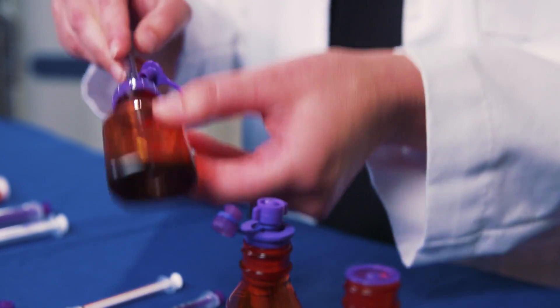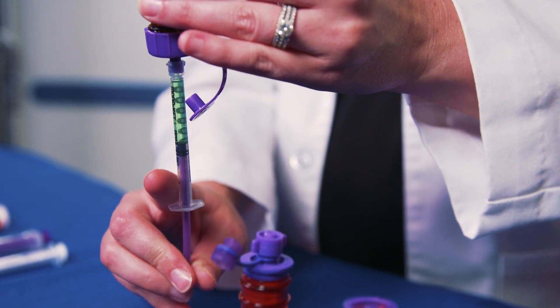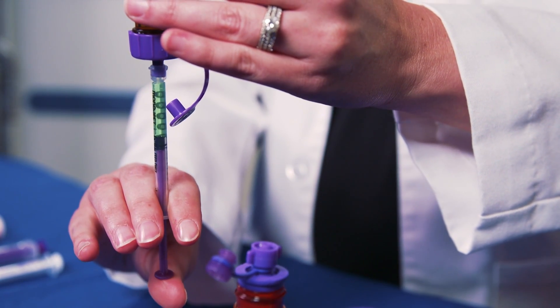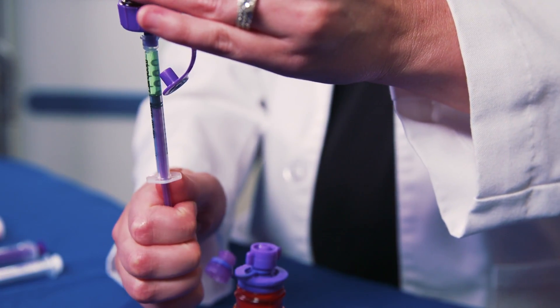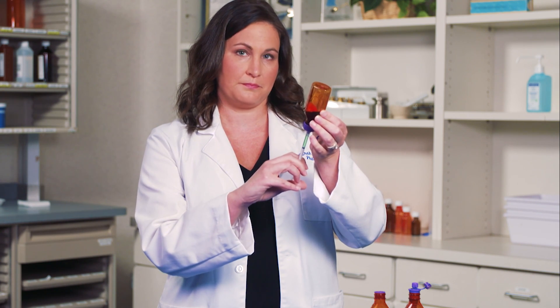Gently turn the medication bottle upside down. In a gentle but quick motion, pull and push back the syringe plunger to cycle it once or more. This helps eliminate any air bubbles in the syringe. Then pull the plunger back to the desired amount. When ready, return the bottle to its original upright position and remove the syringe.